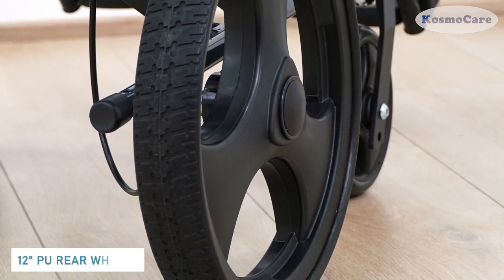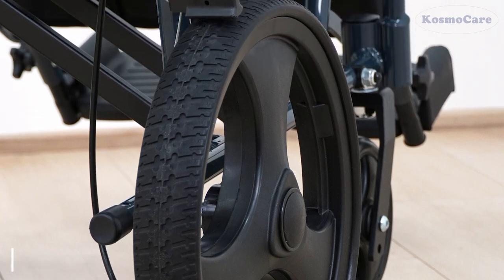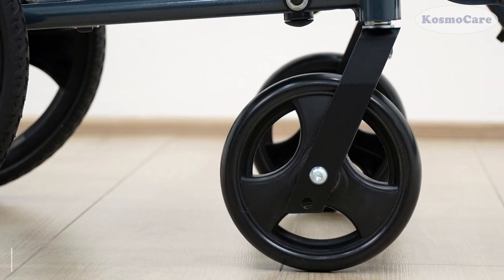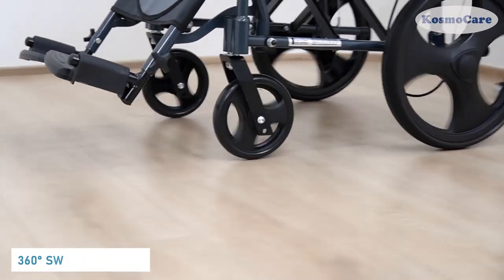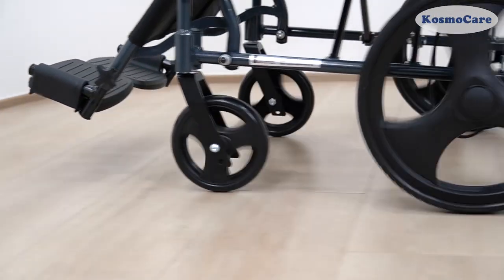12-inch PU rear wheels are maintenance-free, with no air filling required. The solid PVC front casters swivel 360 degrees to maneuver the wheelchair through tight spaces.